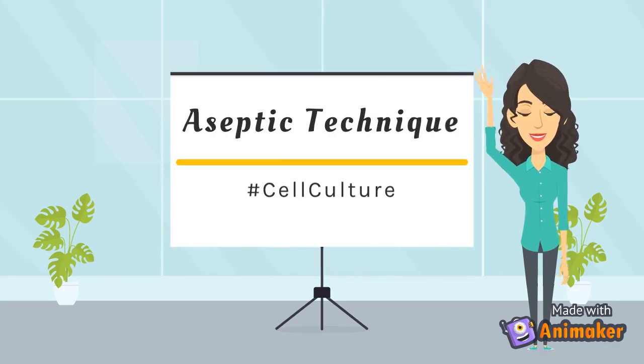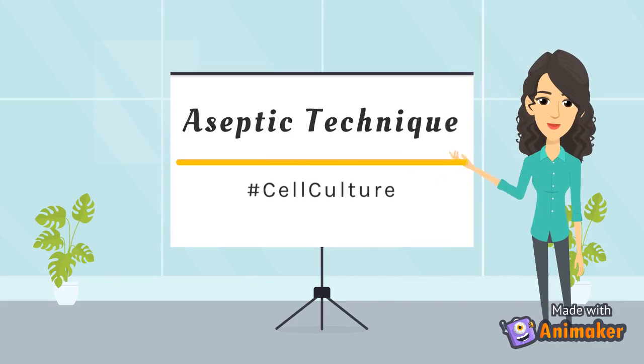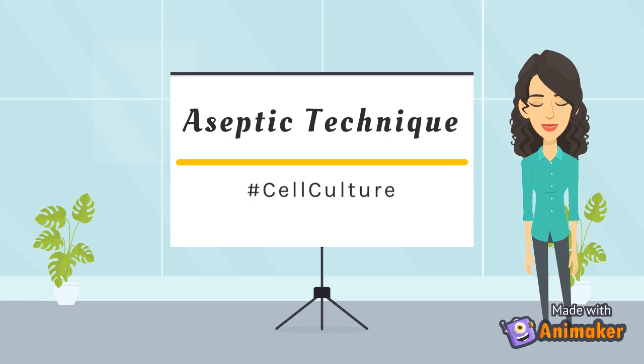Hi and welcome to the aseptic technique video. In this video, we are going to learn the aseptic technique in detail.